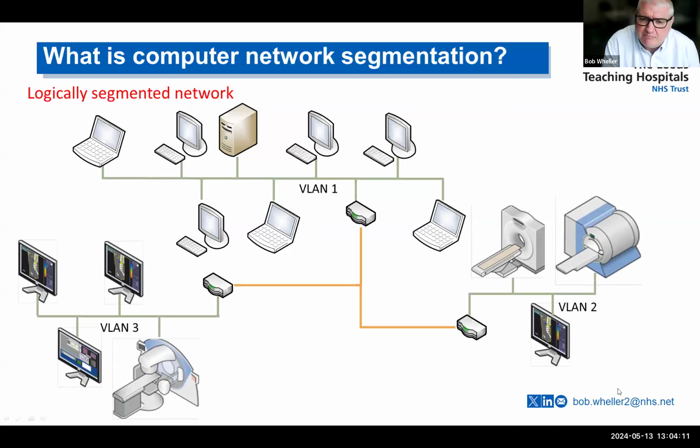But by simply separating the network out into those segments, we've reduced the risk of malicious software. So when we've got this malicious software sat on the standard computer device, it's not monitoring the traffic of our more, shall we say, critical systems.